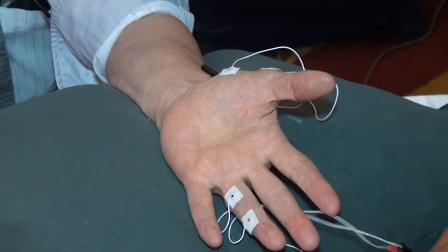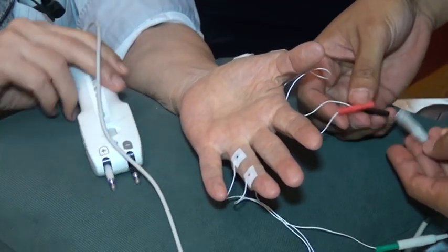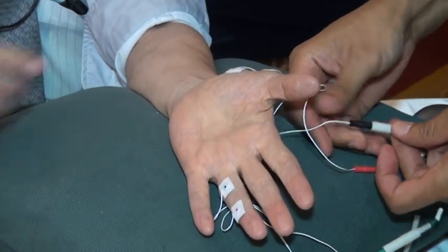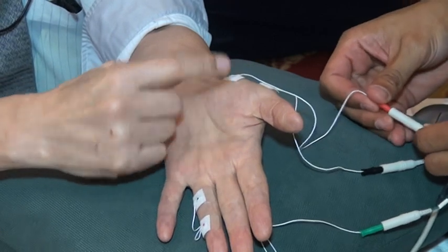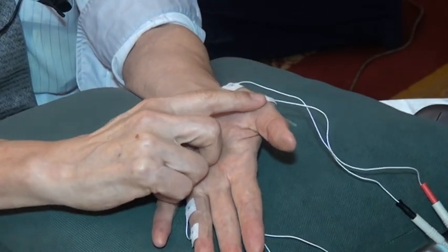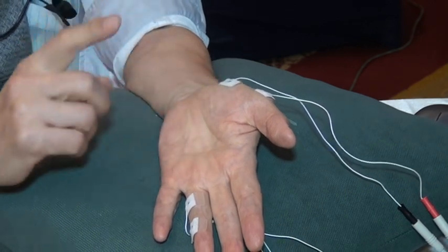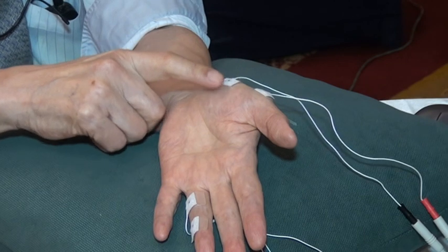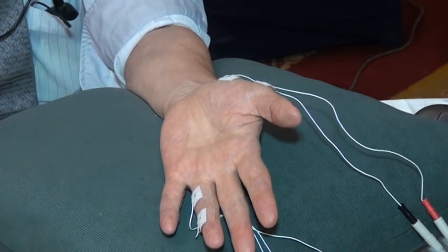But first, let me show you the regular. Let me just explain for those who have not seen this kind of thing. I have two recording electrodes here. One is now called E1. This used to be called G1, grid 1 of the amplifier, but we don't have an amplifier.